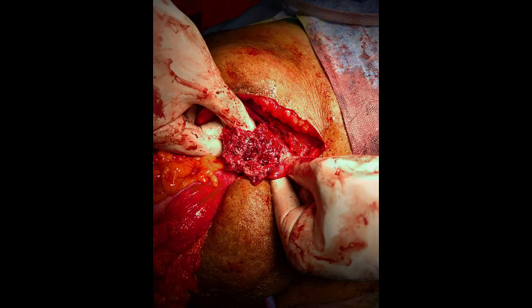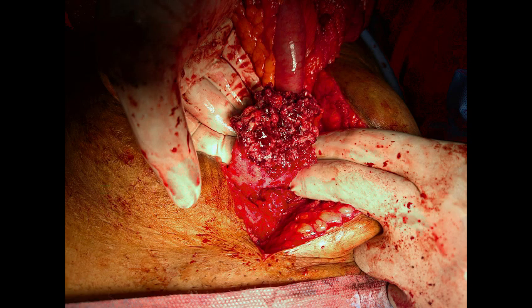Now, upon first glance, we thought that this might be a tumor which has perforated, followed by formation of an omental mass and an omental adhesion. Now, to thoroughly evaluate the lesion, what we did was we went in with a colonoscope, and the luminal area at the region of this mass was completely free of any pathology. There was no tumor, there was no redness, and the mucosa was completely fine.